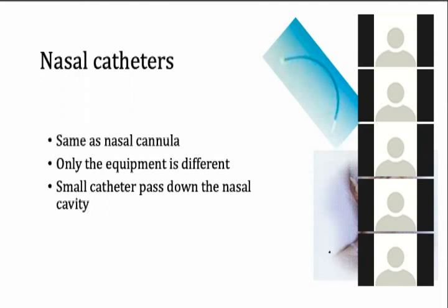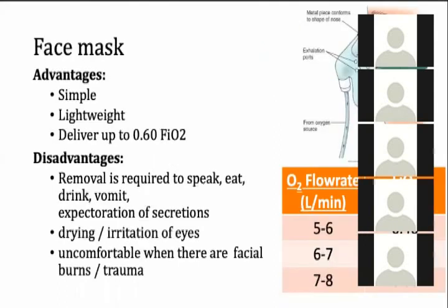Yes, madam. I think you have not seen this device previously, isn't it? This is not very commonly used, but sometimes we use this, and similar advantages and disadvantages are there as with the nasal prongs. And this one is a simple face mask. This is what you have seen very frequently, isn't it?